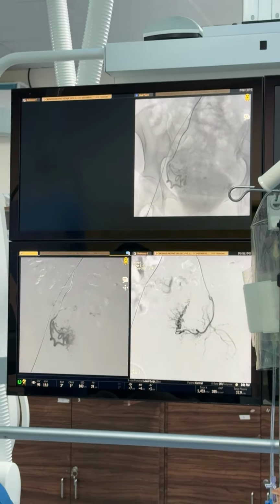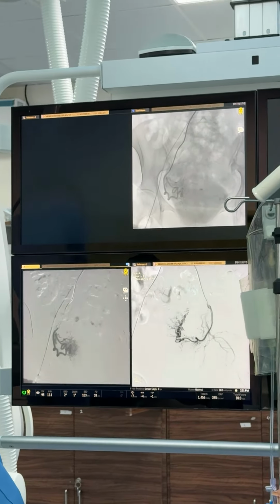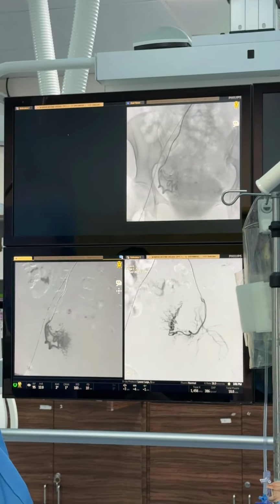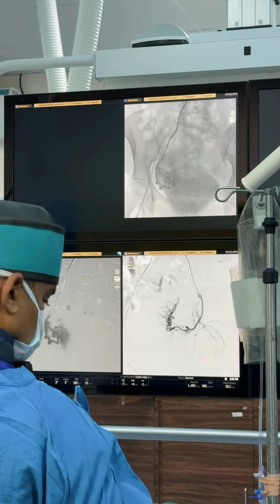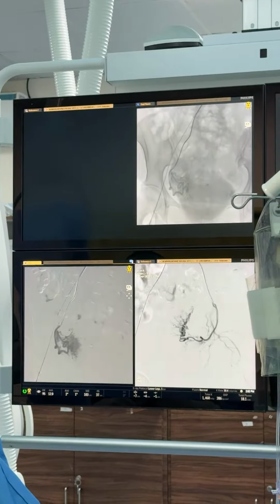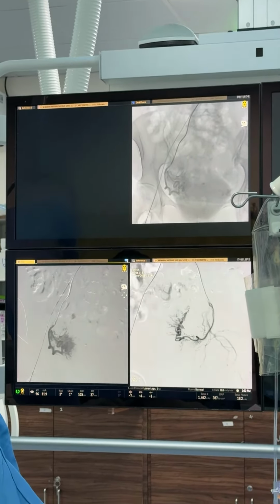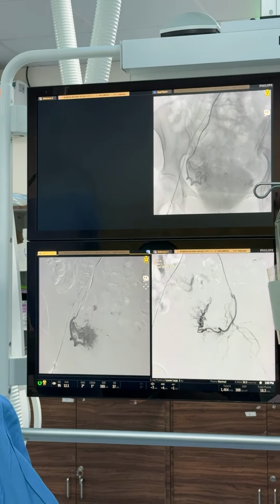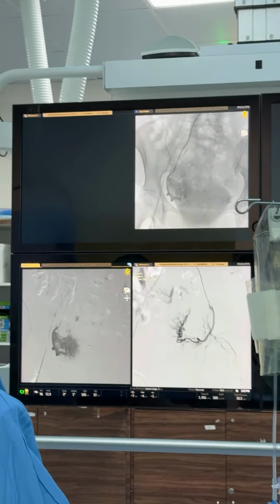So sometimes this catheterization causes spasm, and that's a good thing because you will have a real tight situation to inject forward. But if there is spasm distally, then you can inject some nitroglycerin and reduce the spasm, create some vasodilatation.